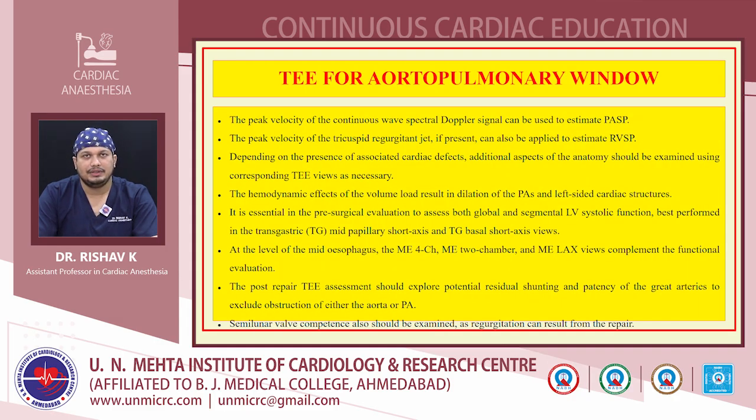So the peak velocity of the continuous wave spectral Doppler signal can be used to estimate PASP, and also if the TR jet is present, we can use it to estimate the RVSP using the simplified Bernoulli equation and its derivatives. Depending on the presence of associated cardiac defects, additional aspects of the anatomy should be examined using corresponding TEE views as necessary.